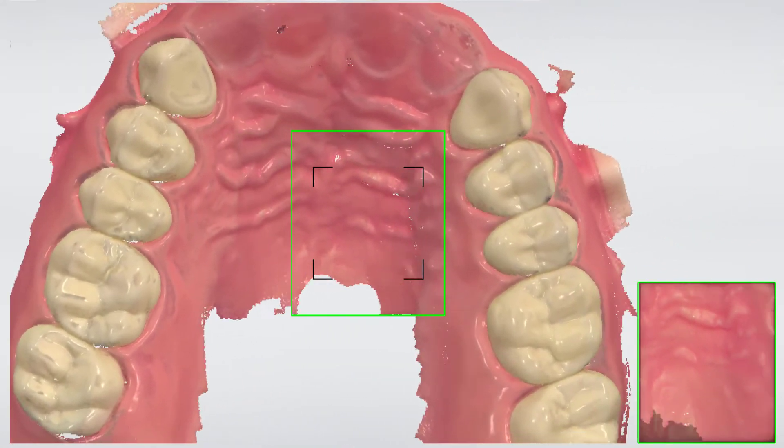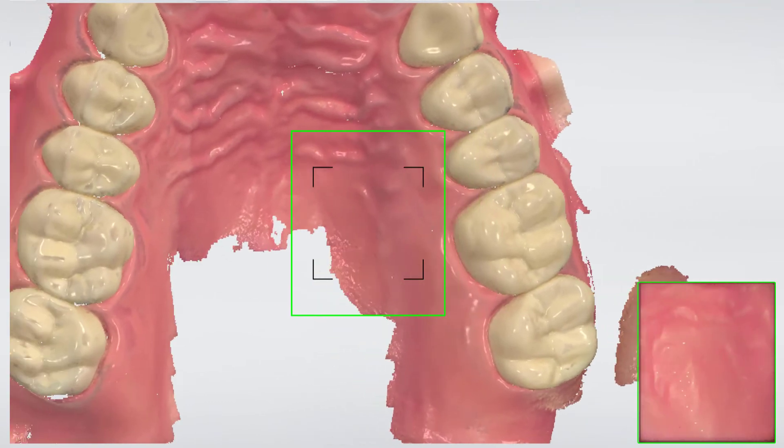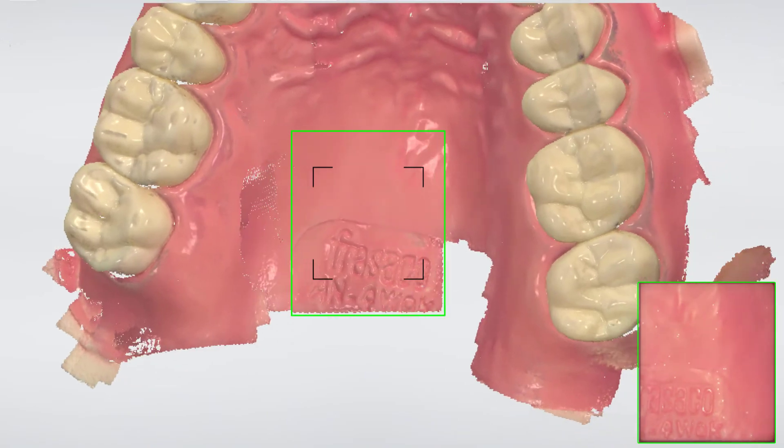On the inside, we want to scan the palate to use it to stabilise the guide. While scanning the palate, use the S shape, moving down the palate to capture the desired area of soft tissue.